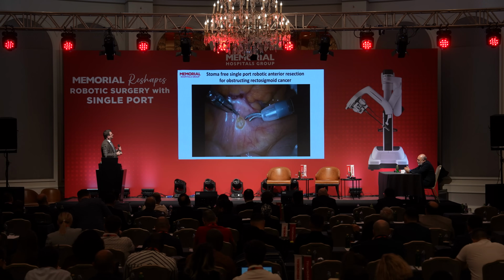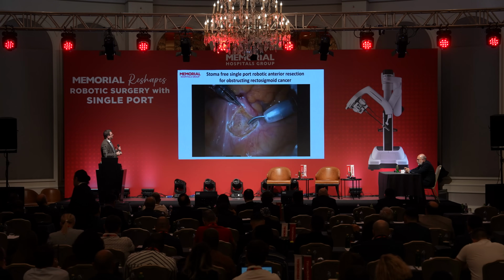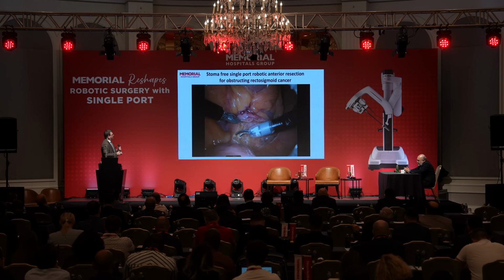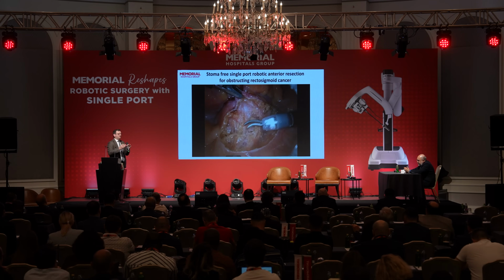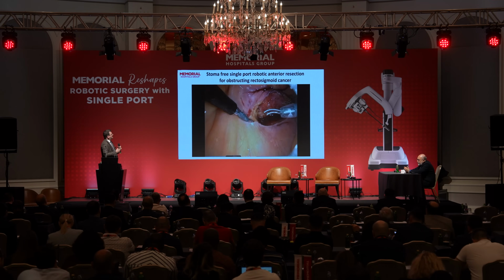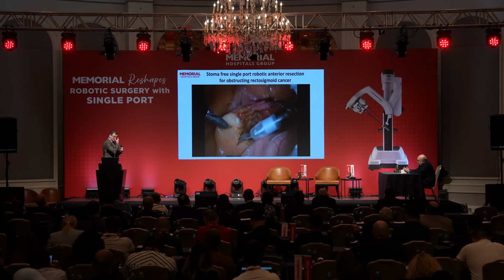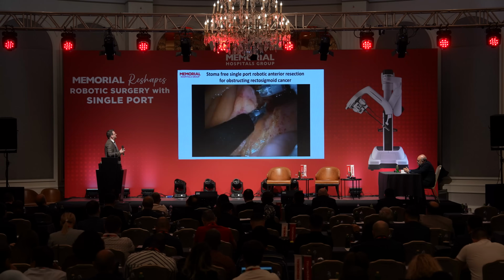This is our case with single port. This is a T4 case that we did a couple of days ago. So it's maybe not a good selection for participation, but the mentality is the same. If you create proper traction and countertraction, you are just trying to find the planes, then you move forward following the planes. We are doing a medial to lateral fashion. This is our tradition. We don't do lateral to medial, but this is completely related to your experience.